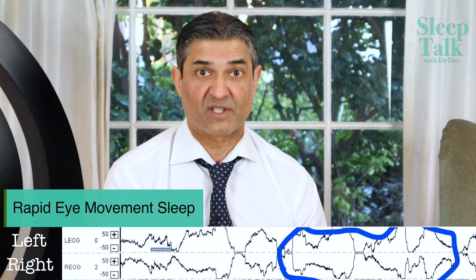It's amazing how we can distinguish whether you're awake and whether you're in deep sleep. Alpha, delta. And the top two lines denote the eye movements. The up, down is the eyes moving left, right, left, right, like windscreen wipers. This is called rapid eye movement sleep or REM sleep. This is the time when we dream. Now generally we cycle in our sleep. Non-REM, REM, non-REM, REM, every 90 minutes or 2 hours.